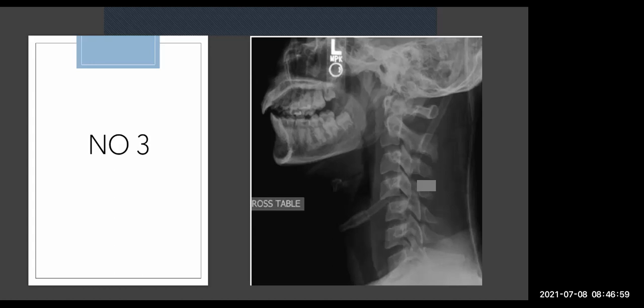It's moved out. Agreed. So is our spinal cord at risk? Yeah, it's highly at risk, isn't it? Because the spinal cord is essentially there, and then getting pushed back and then carrying on there. Okay. And then if we look at the posterior line, and you see again, it pops backwards this way, all right, as these are moved out of place.